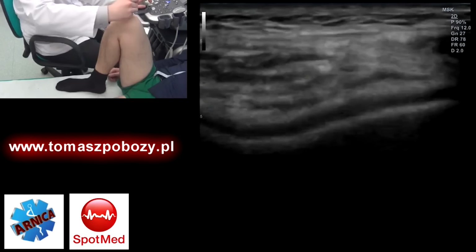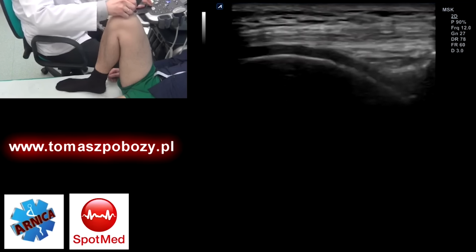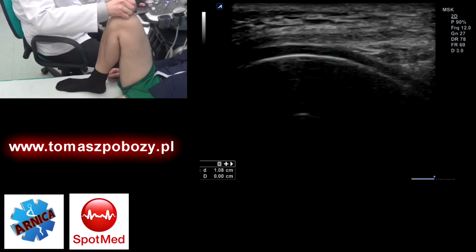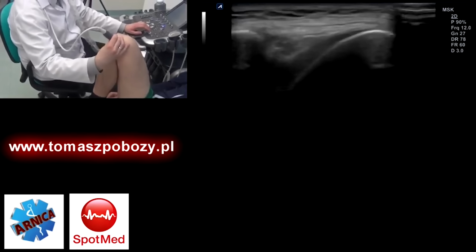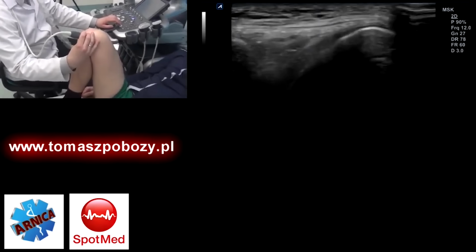On the exported recording, the image appears slightly less distinct because the compression is not lossless. In the central region, there is also mild thinning of the cartilage. These findings represent a borderline appearance between normal and pathological, consistent with early chondromalacia.